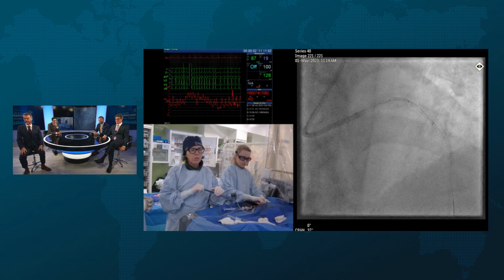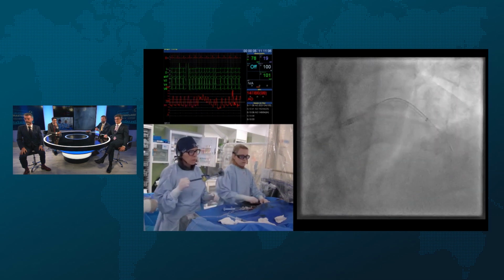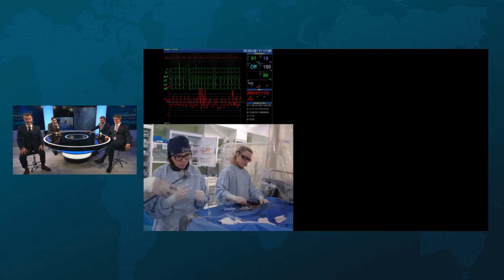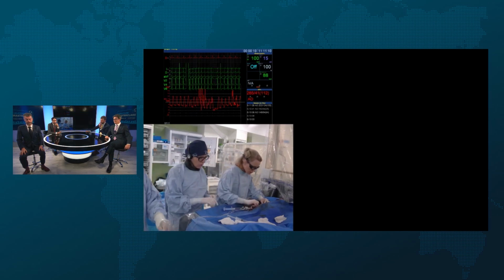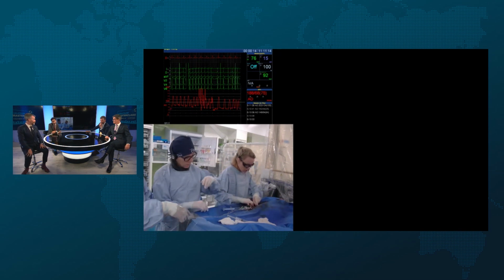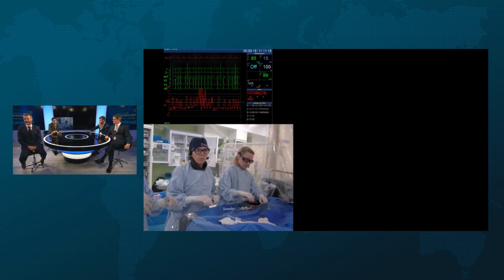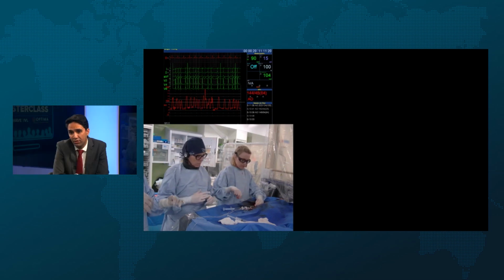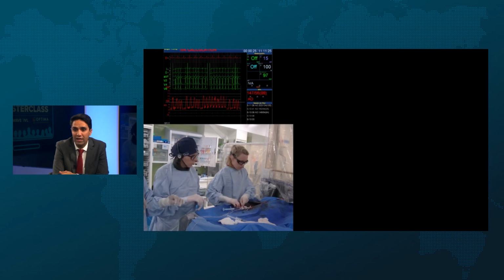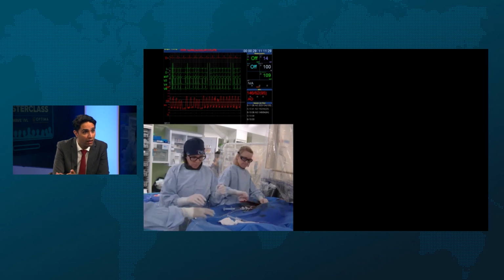What about thicker stent struts for nodular reprotrusion? Does anybody think it reduces the risk of nodular reprotrusion, especially with eruptives? It's a great question. Who knows? But it's certainly a very important point to think about. I actually use the 3-connector cell stents in nodules just because I think I have an extra bit of metal that might help prevent it. Yeah, that's the hypothesis.